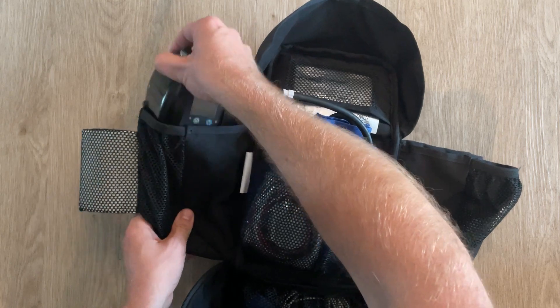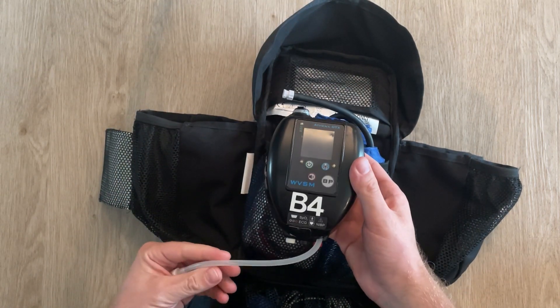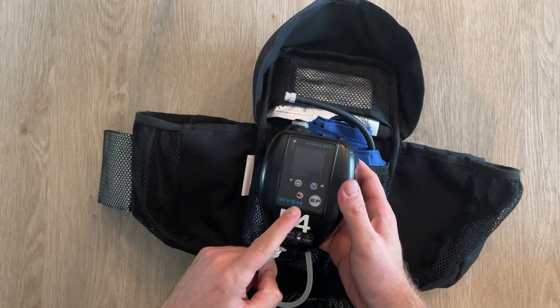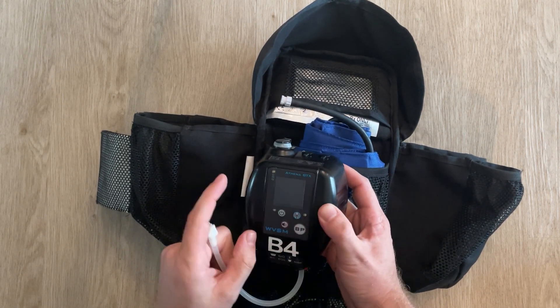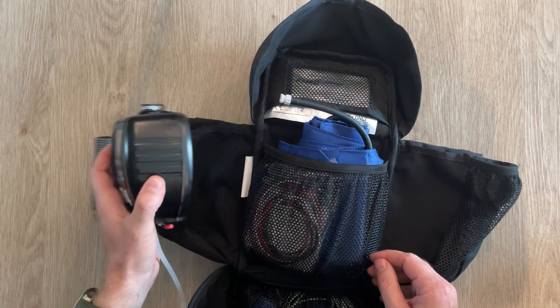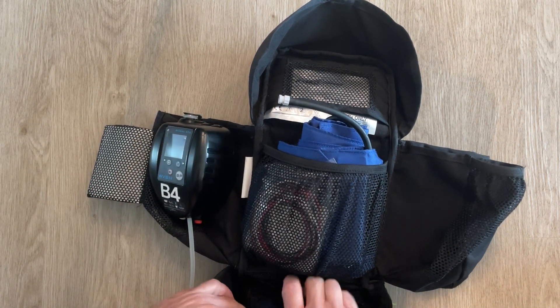I've only got the one — they were kind enough to let me borrow it for a while to test. As you can see, this one is designated B4. WVSM is the designation of the device, Athena GTX is the manufacturer, and it comes with a full monitoring setup. It's really pretty neat.